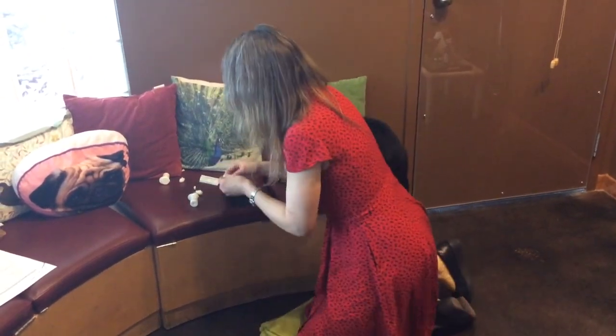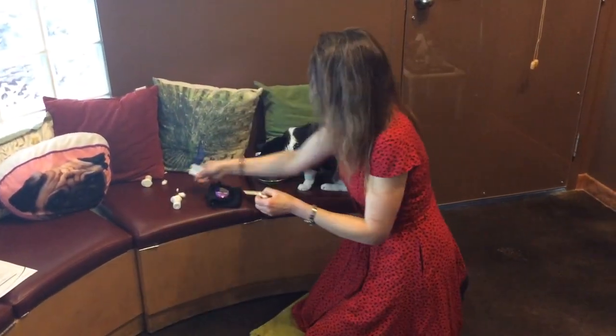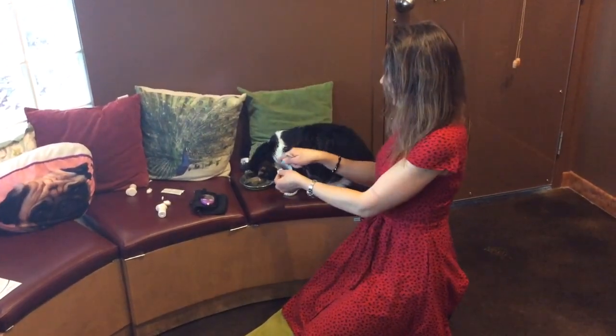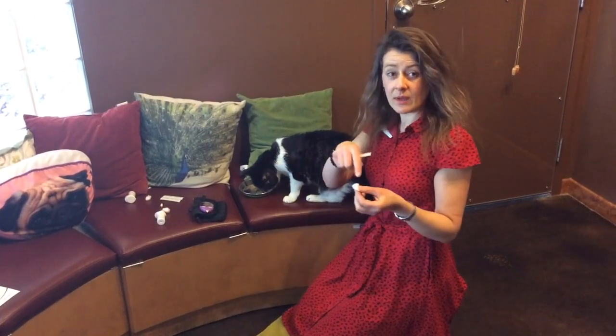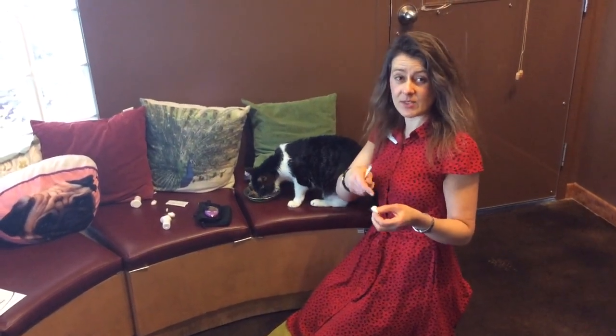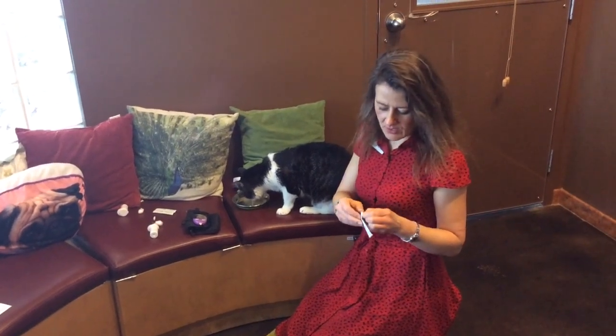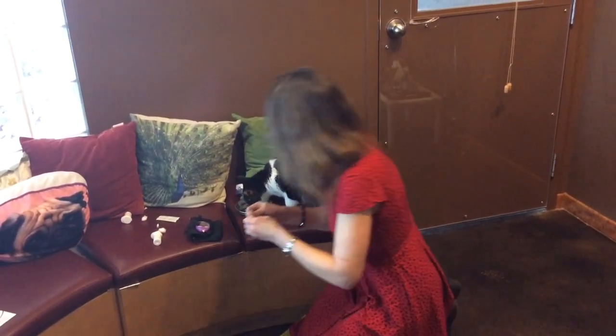Next, I use a Kleenex or a cotton ball to place on top of my finger so that when I prick the ear, it won't pierce my finger — it will only pierce the cat's ear to get the cat's blood and not my blood. I use a 22 gauge needle; it's a little bit bigger of a gauge.